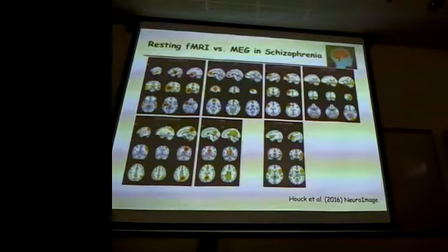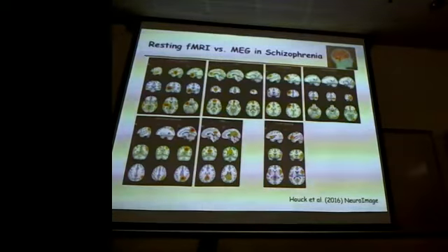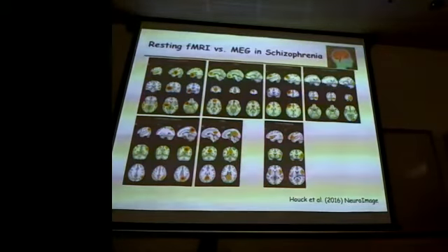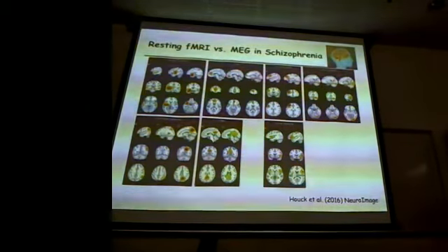You can do simultaneous recording, and currently most of my studies are actually simultaneous EEG and MEG. Part of that is for the translation argument, because the argument that comes back from people from NIH is that, well, MEG isn't very widely available, so how is this going to translate clinically? If you collect both MEG and EEG, with MEG being the more research piece of that, you can look for maybe a less sensitive marker in EEG, then you can translate it to the clinic more broadly.